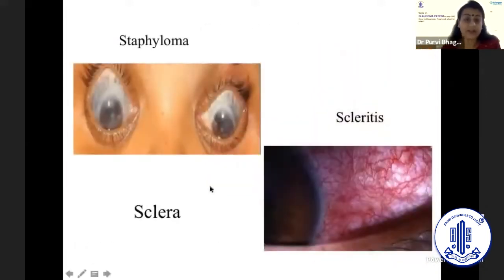Examination of the sclera, again, very important. You can see often these staphylomatous eyes. So if you're planning to do any surgery, you might want to consider pre-operatively where you'll be making your incision and the surgery, what would be the dose and concentration of the antimetabolite that we will be using, if at all, or you might want to perhaps go for an alternative like Ologen. And again, in cases of scleritis, you may want to consider treating these conditions first rather than going for an intervention.